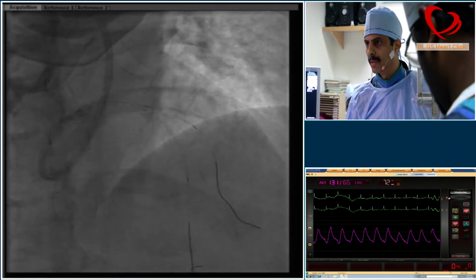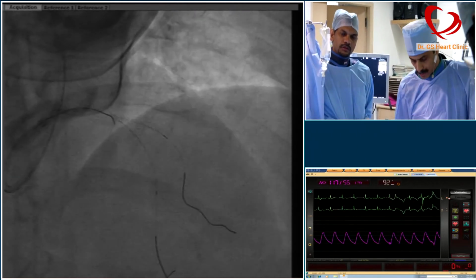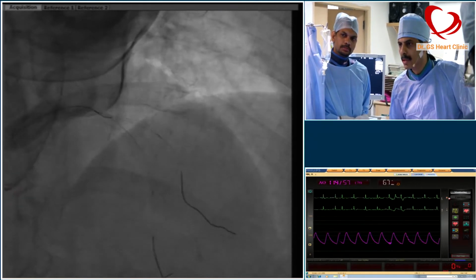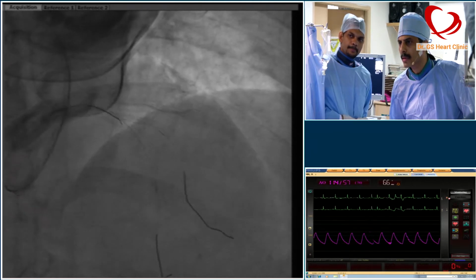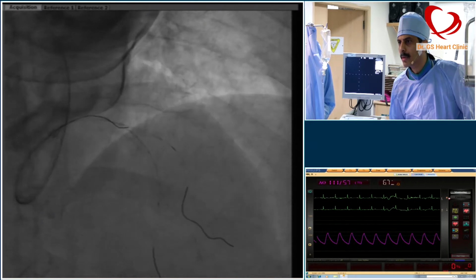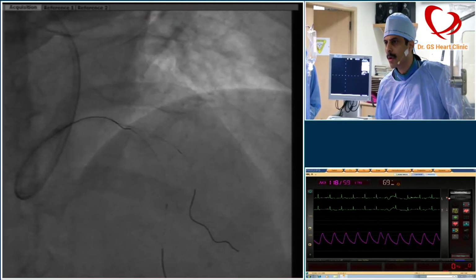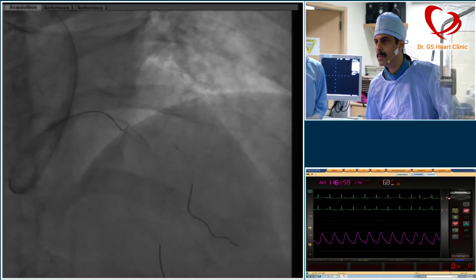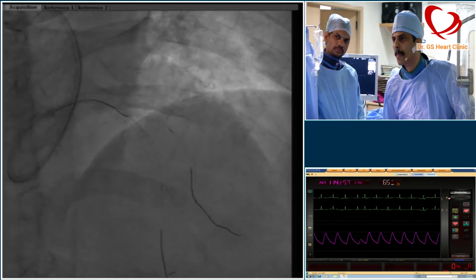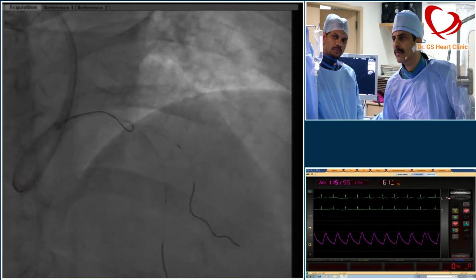So give me a 2 millimeter balloon, or we recross it to another strut. We are trying to cross it a little. The strut probably has gone to a very narrow strut and it wouldn't cross. So we will probably try to cross with another next strut, which will make it a little easier for the balloon to cross. Other option is we can try using a smaller balloon. We can give you also a 1.5 balloon, and if it doesn't go, we can use that.